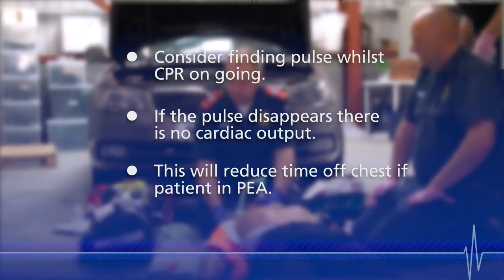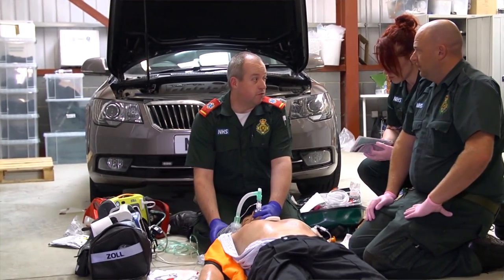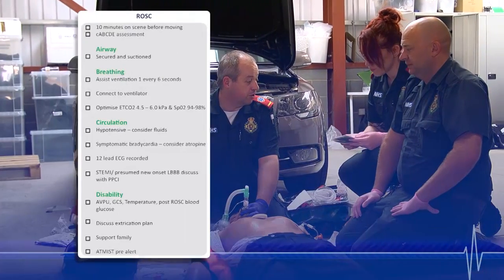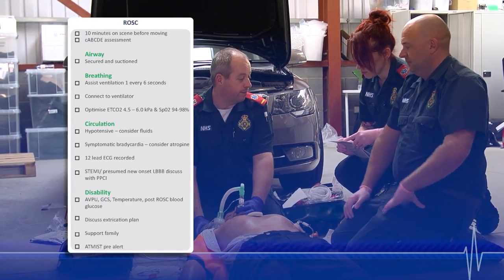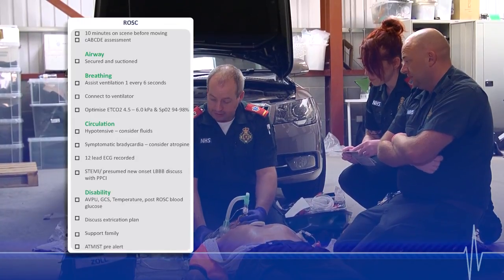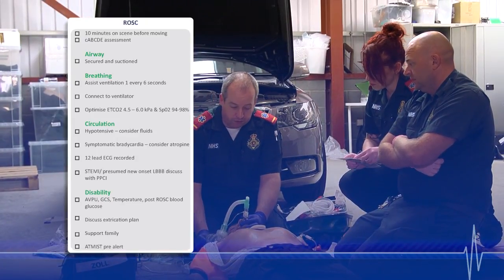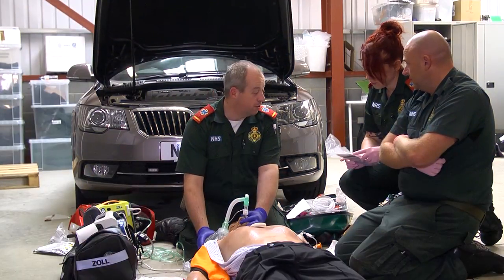Okay, can we note that time? Yeah, time is 13:48. Can you start the post-ROSC checklist? Yes, because obviously we're not going to attempt to move for 10 minutes, so let's run through the post-ROSC checklist. It is important to use a post-ROSC checklist to ensure nothing is missed. So we've got airway. Okay, I'm still happy with his i-gel. End tidal's improved, but there's no respiratory effort. Do you want to get it secured? I'm happy at the moment until we come to move, yes.